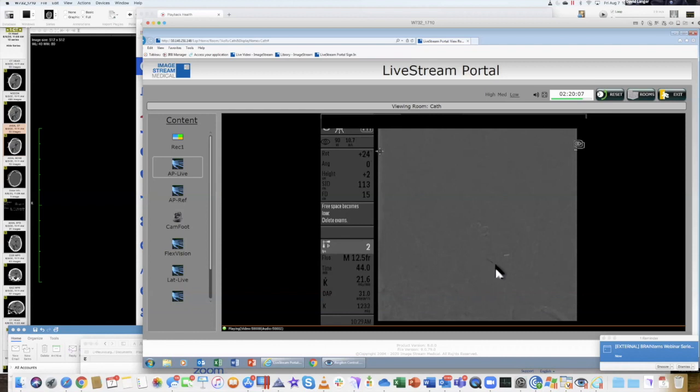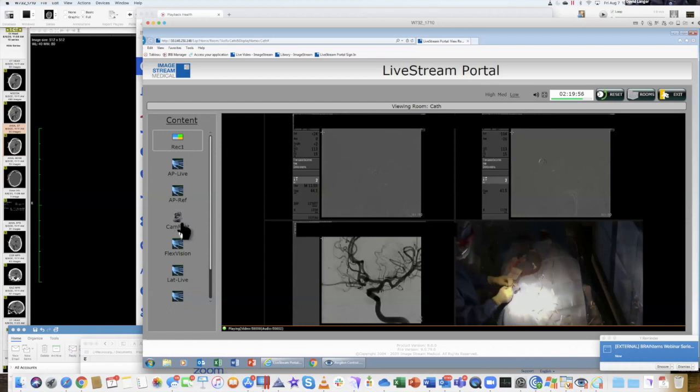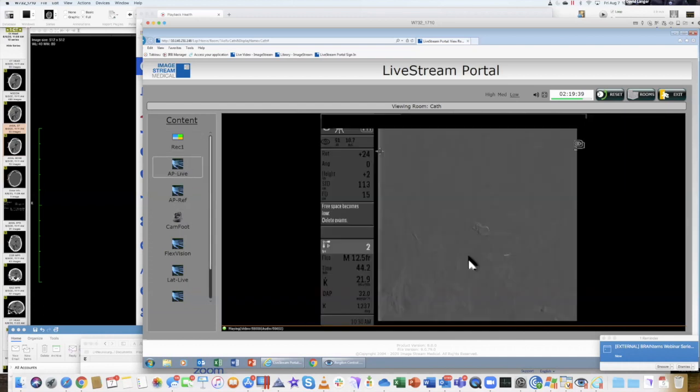So now he just took the catheter out. Took the pusher out, and now he may be done. Let's see. Look at his hands. Yeah, he's done. So he's going to start taking the catheters out, I think. He's advancing a little wire up there. You just push the wire to the edge of the catheter, just to make sure that the coil is completely out of the tip of the catheter. Then you can pull the catheter out.